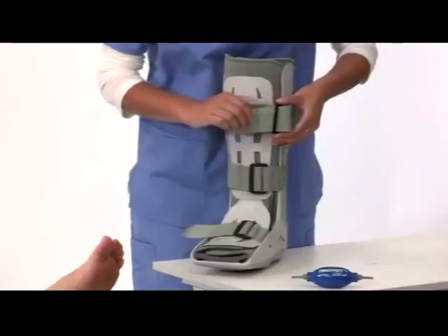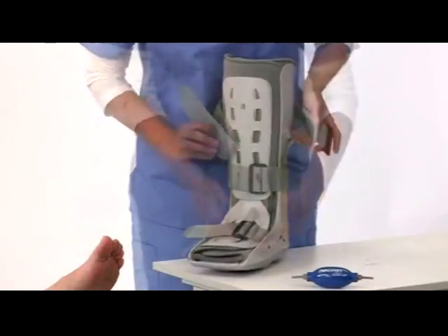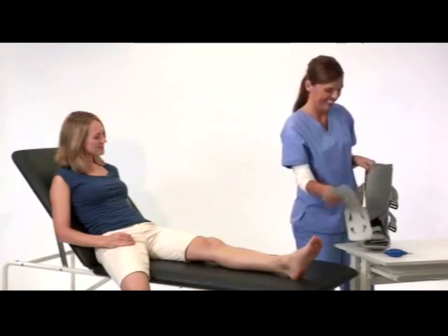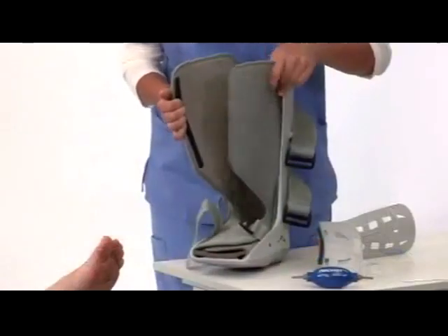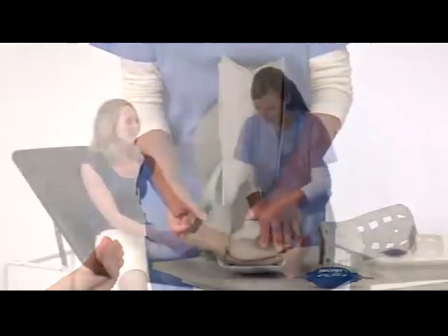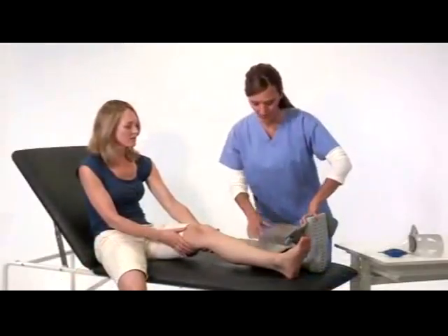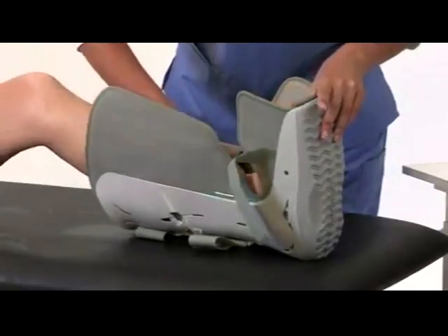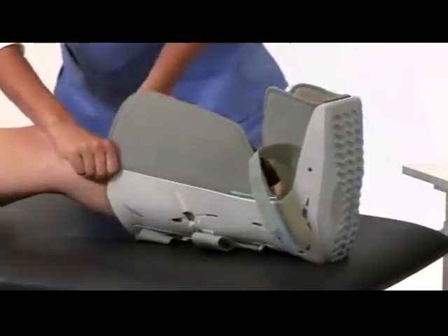First, unfasten the straps, then remove the front panel and open the liner. While seated, place your leg in the brace and position your heel in the back of it. Pull the liner up to remove any wrinkles.